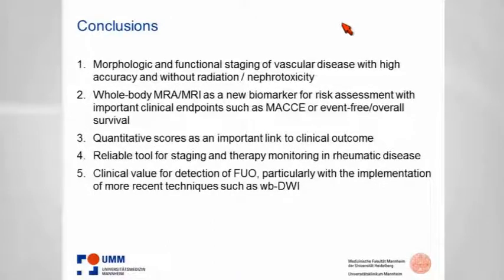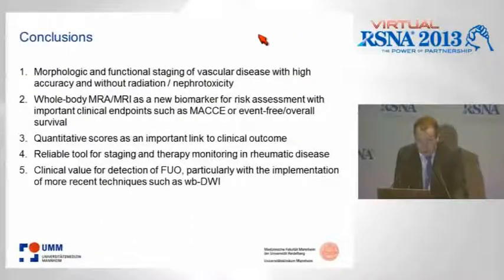So in conclusion, morphologic and functional staging of vascular disease is now, I think, without doubt possible with very high accuracy, and there should be standardized protocols available on every scanner to do this robustly with high accuracy.